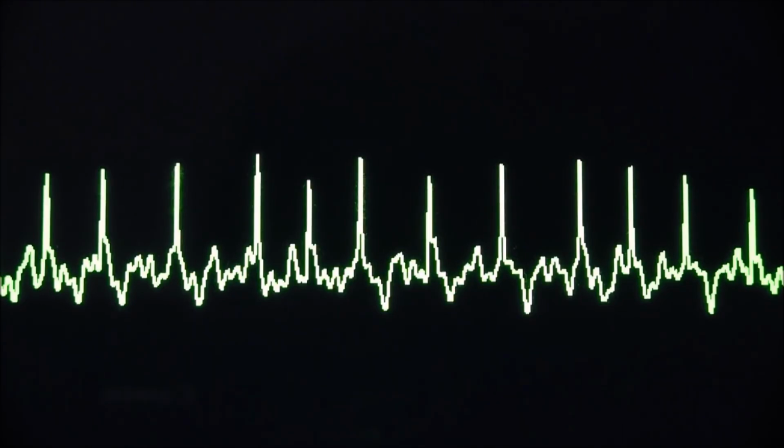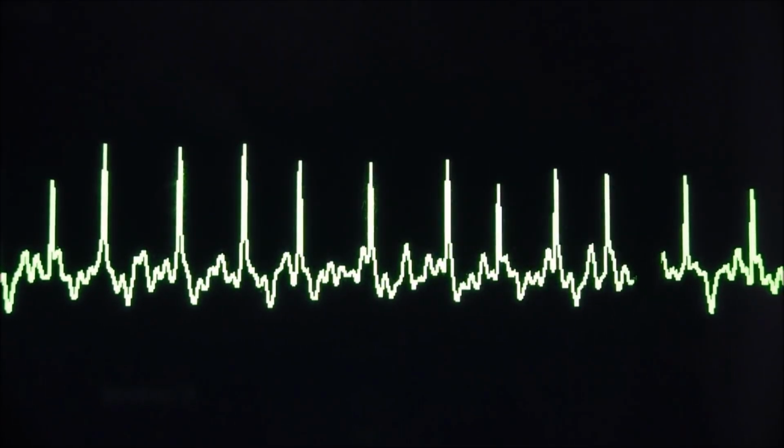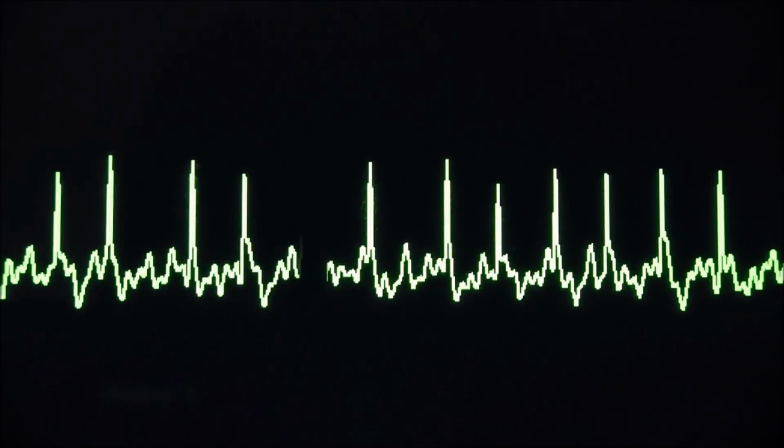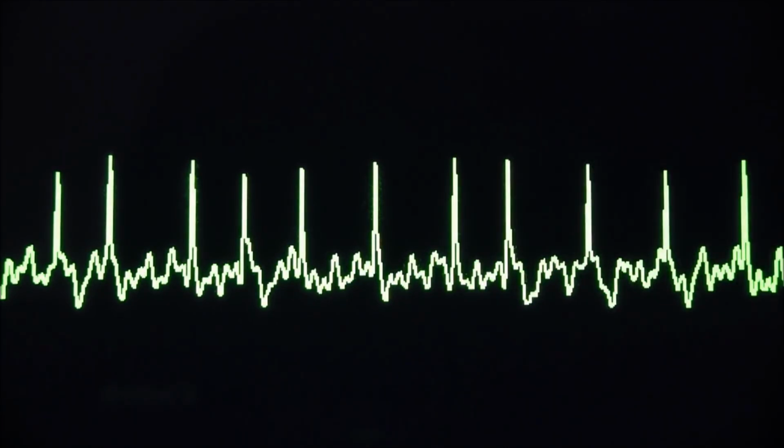Now if this is acute in onset, we can actually treat this with, the machine's alarming because it doesn't like the fast rate. If this is acute in onset, we can actually treat this by anaesthetising the patient and defibrillating them. Because there is fibrillation there, it's just that it's atrial fibrillation, and that can restore sinus rhythm. If it's more long-standing, we'll often choose to treat with medication.